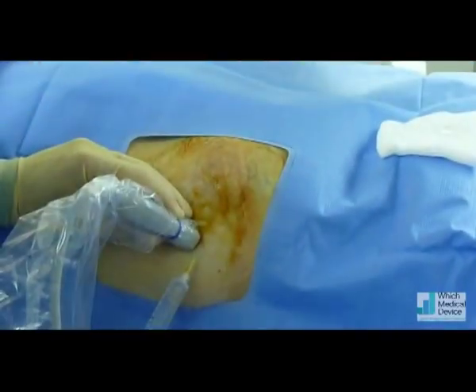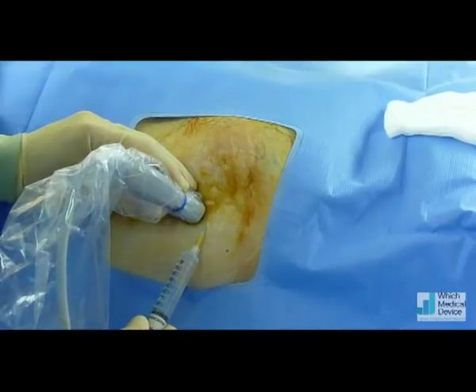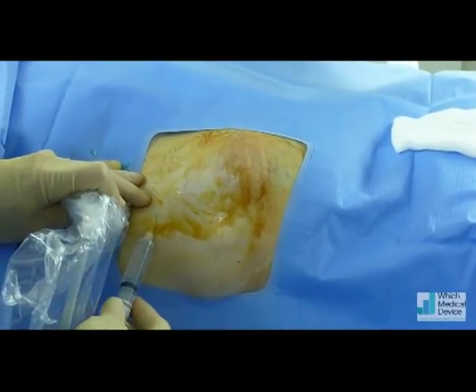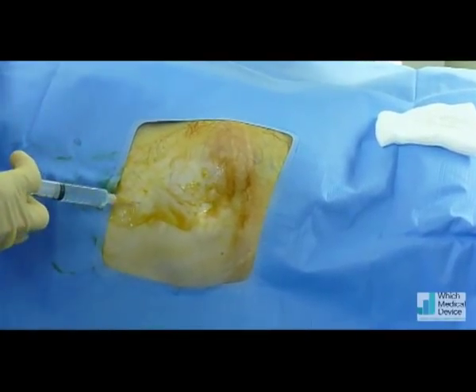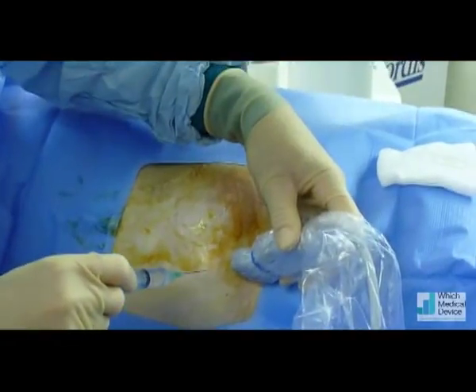Sharp scratch now — it's local anaesthetic going in. It will sting a little bit. Going to get some more local up here as well, a little sharp scratch. Bit of a sting.